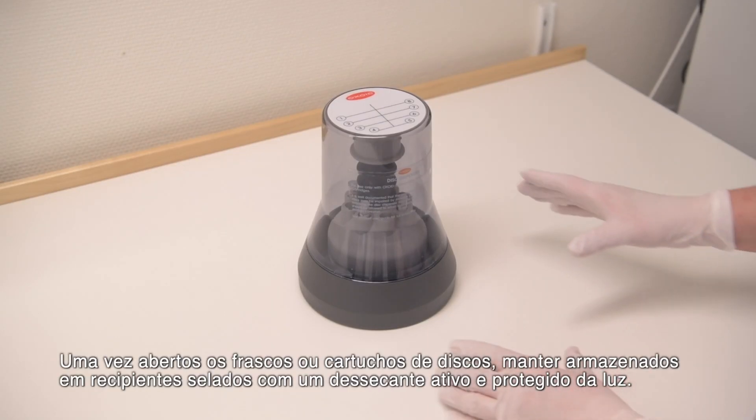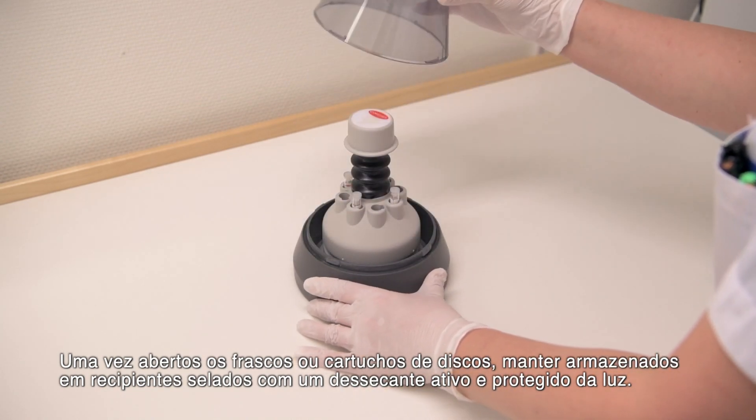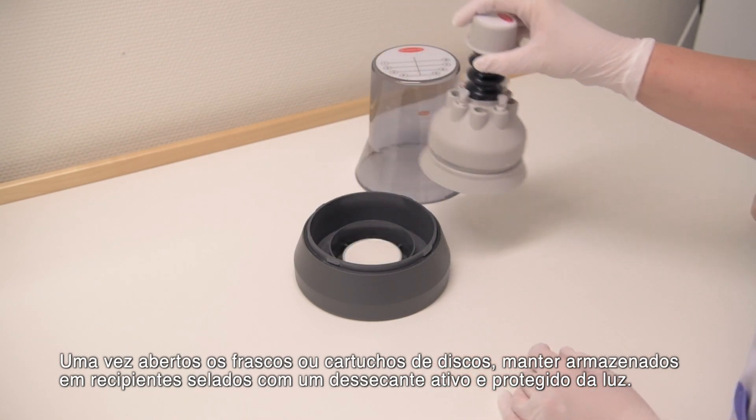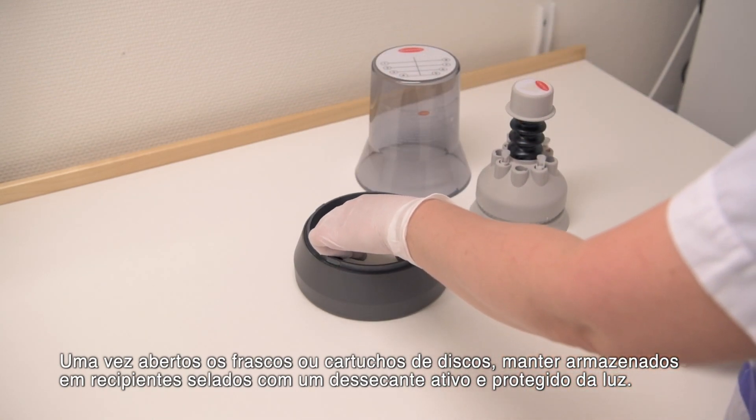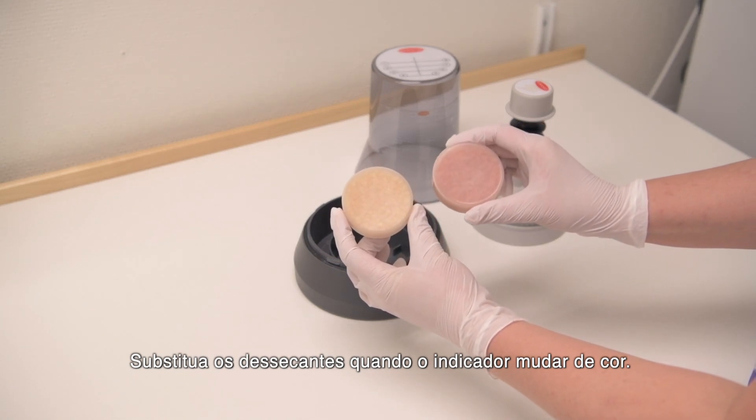Once disc cartridges have been opened, discs shall be stored in sealed containers with an active desiccant and protected from light. Regenerate desiccants when the indicator changes colour.